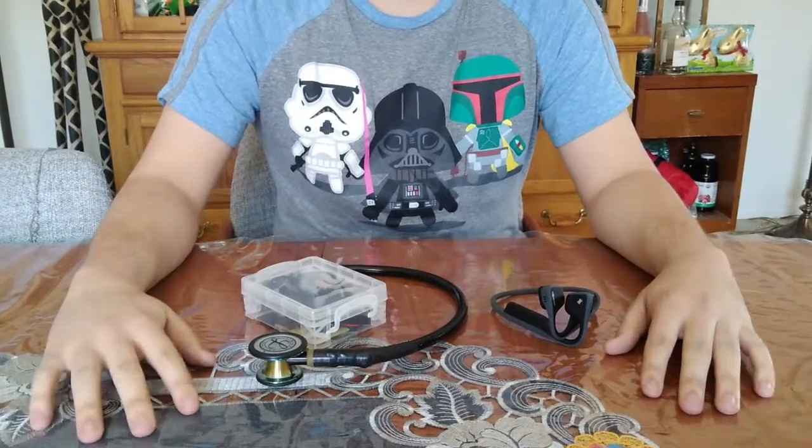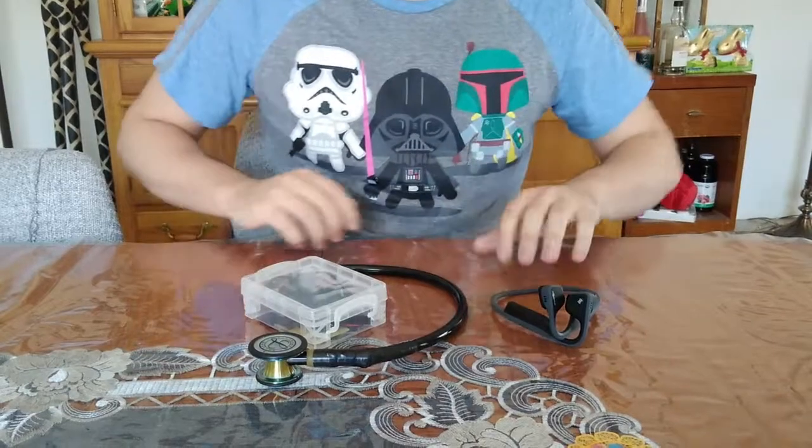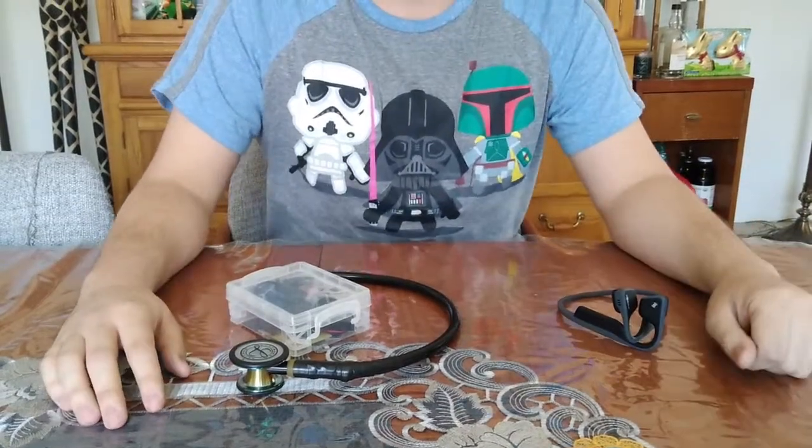We decided that there were two improvements we could make upon the stethoscope. First of all, we made it electronic, and therefore wireless, so that a doctor does not need to be tethered to their patient.